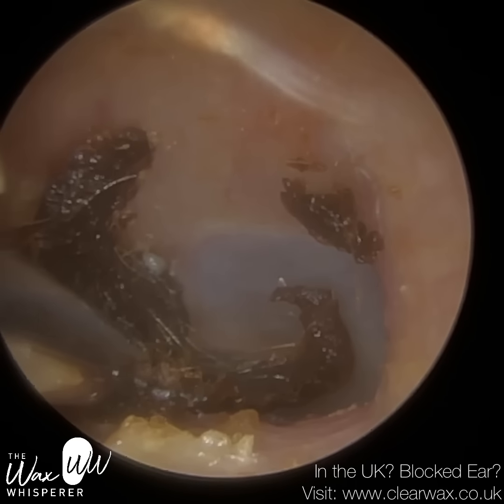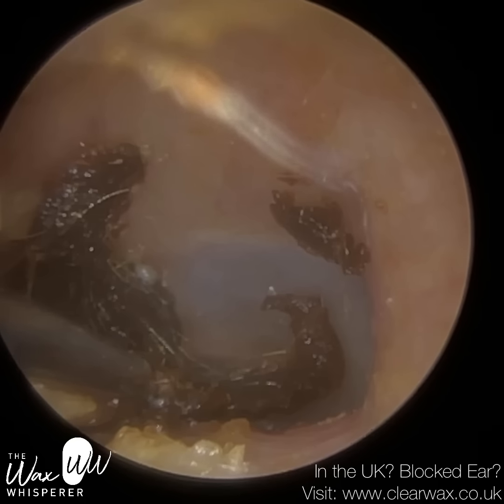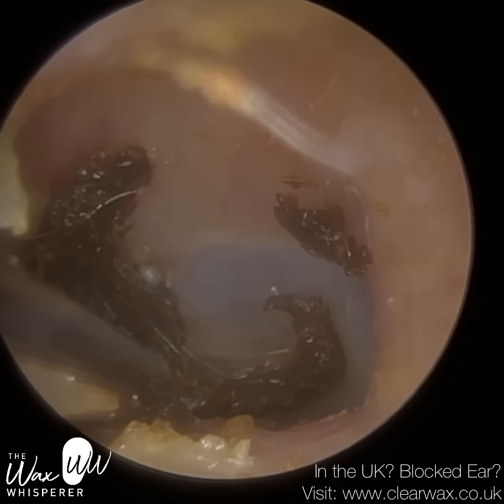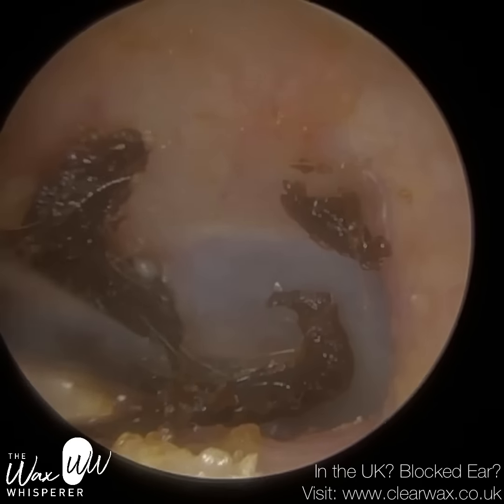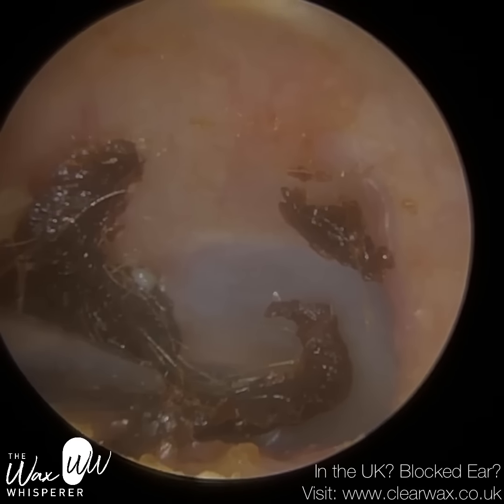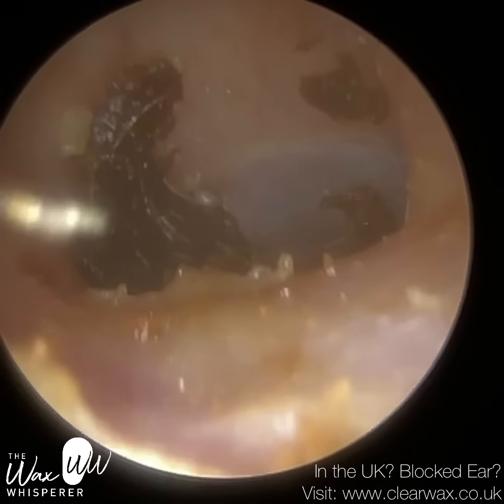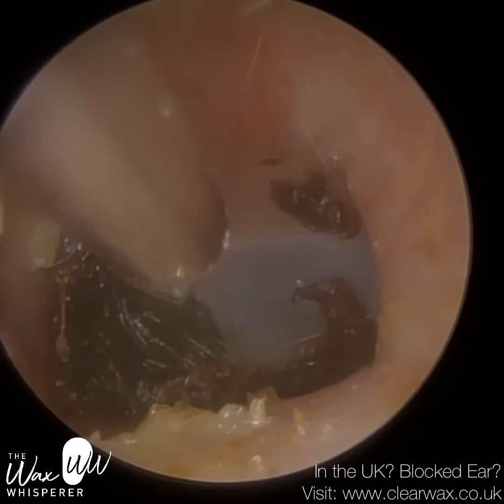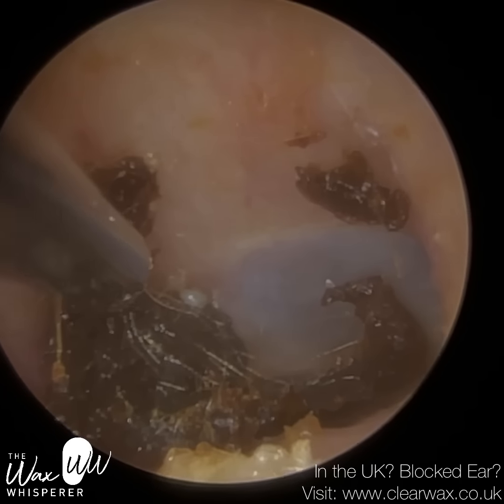So again, I'm just trying to go to the front part. Now, when I'm trying to lift this away from the front part of the ear canal, I'm trying to detach it because it's stuck. We've got to be careful not to push this wax against the eardrum, because the wax is already on the eardrum and any more pressure will be uncomfortable for the patient. So I'm just being as delicate as I can. And this is with clinical ear care, sometimes you just have to come back out, reevaluate, and go back in and just steady yourself almost.